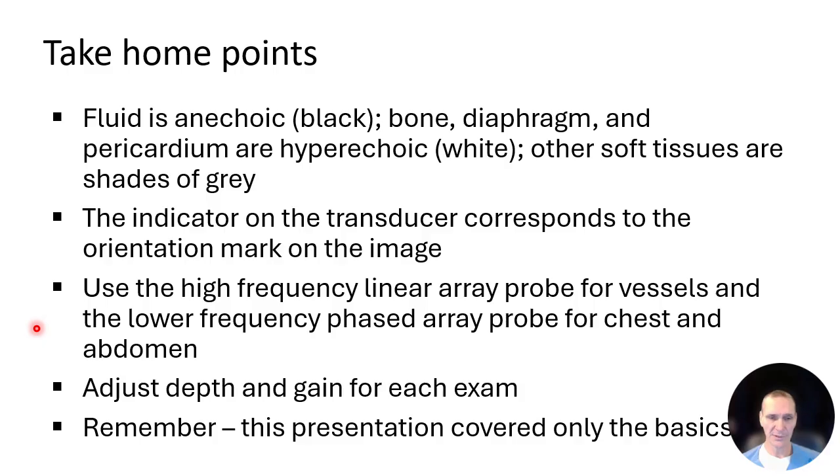Probably the most common mistake I see is the depth is off for new learners. So always think about the depth when you scan. Think where your structures are and adjust the depth. And then also you want to adjust the gain for each exam. And then remember, this presentation covers the basics. It will get you started, but there is much to learn about ultrasound. It's an entire science. However, I feel this is enough to get you started.